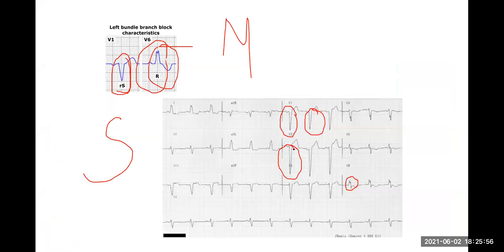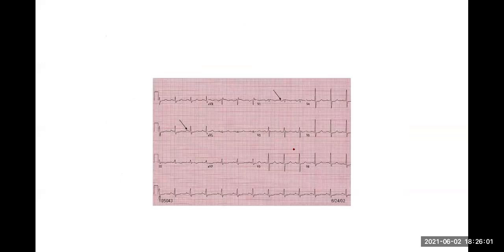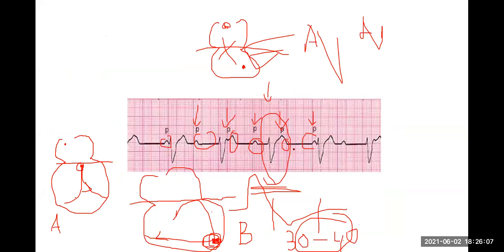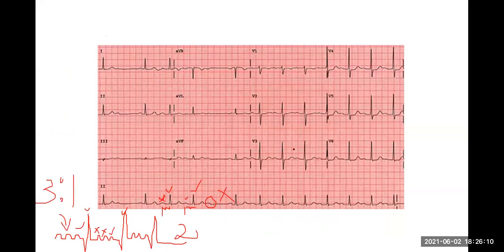Excuse me, sir. Yes. In second degree heart block, Mobitz type 2, can we have an irregular rhythm in heart rate? You can have anything. For example, if the block is occurring regularly, you will have a regularly irregular rhythm. You can get it. Thank you, sir. Okay.